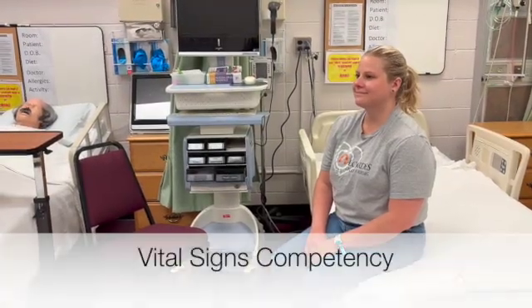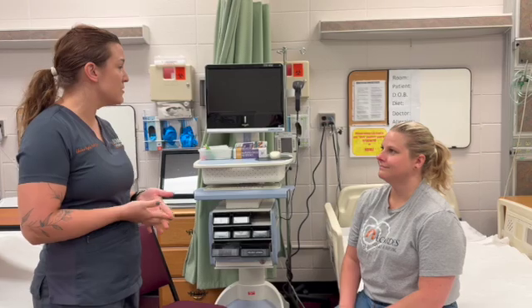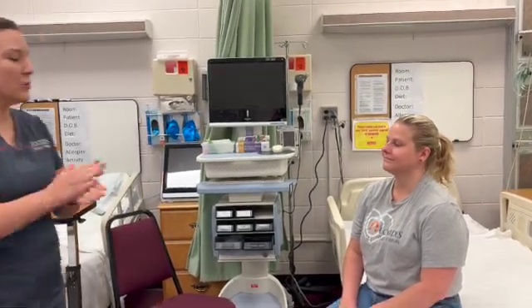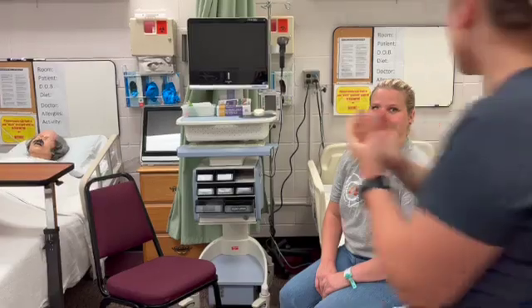Come in. Hi, my name is Chelsea. I'm going to be your nurse today. I've come in to perform a set of vital signs. Is that okay with you? I'm just going to perform some hand hygiene here and I'll pull the curtain over here for privacy. And then can you just verify your birth and last name for me?